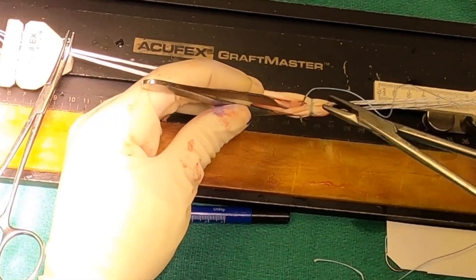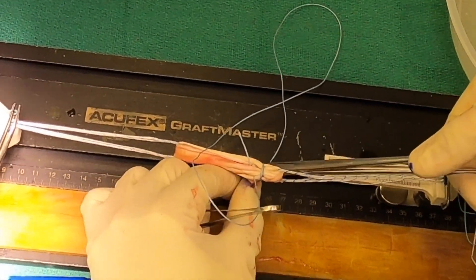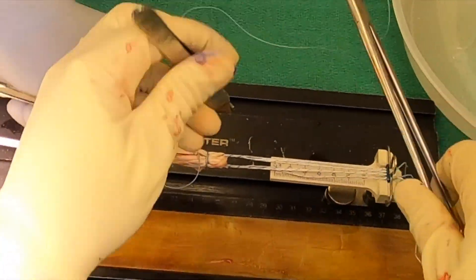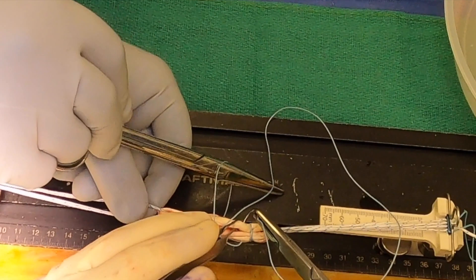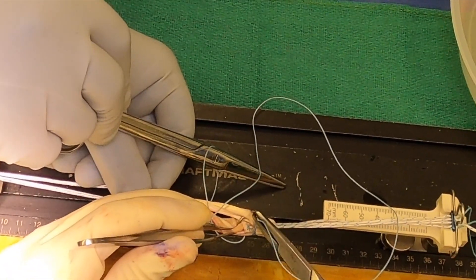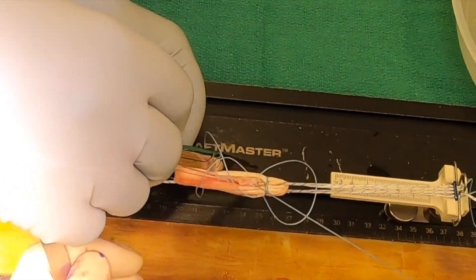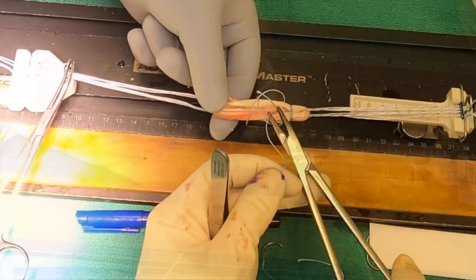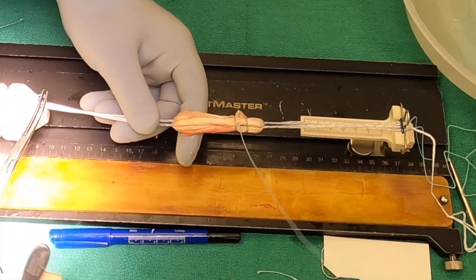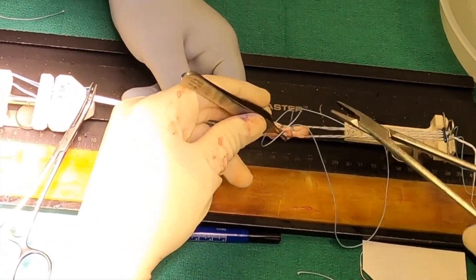We'll now do the same thing on the femoral side — two of these together to make sure we capture both of the graft limb ends so those are secured. Suture over twice and then outside to inside once again, retrieving that inner one to pull it back up into the center of the graft bundle, pull it through, cinch it nice and snug, and tie it in an identical fashion, again burying the knot in the middle.